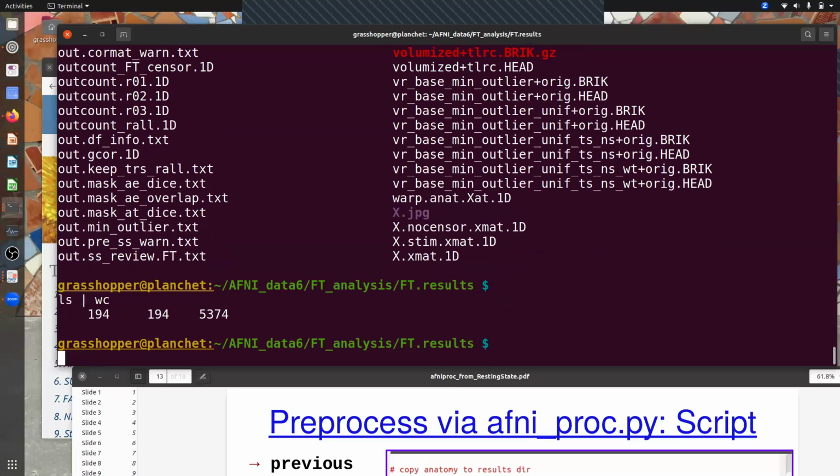Now, some of the files have pairs of data and header files, so it's actually less than this. But there's a lot of things here to sift through. This is because, in general, there are a lot of different philosophies for when you're processing data. What do you want to do? What do you want your result to be? Well, I just want my answer, so I go on with my life and write my paper, right?